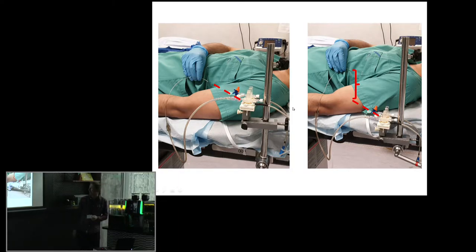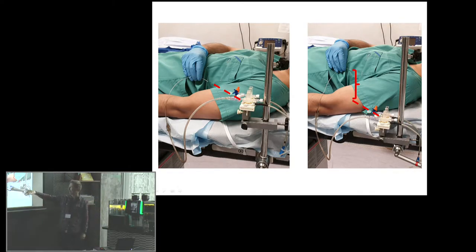Another thing with the fluid-filled catheter is that the pressure transducer needs to be at the same level as the tip of the catheter you measure with. So if you have the heart at this height, you have to have the transducer at the same height. Over here, it's connected to the table, and that's quite a common mistake. You just go to where it's easy to fix it. But that actually generates a vertical fluid column. I think 4 centimeters of water is equal to about 3 millimeters of mercury.